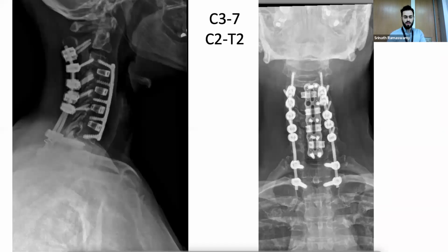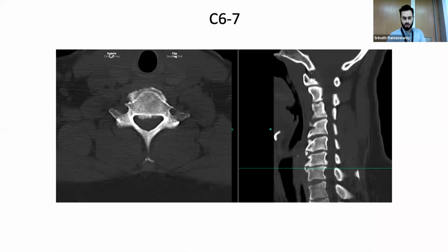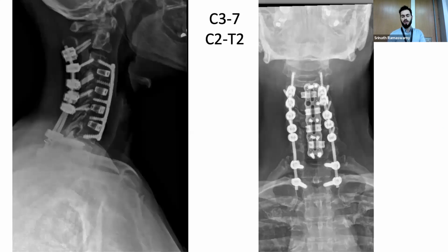So on the CT scan, by the way, you can see this, what looked like a disc is disc osteophyte. So you actually have pure bony stenosis. This is the actual size of the canal. Nothing stands a chance against that. The cord is very malleable, and sometimes it goes down to half of what it really is. So she was my first case.